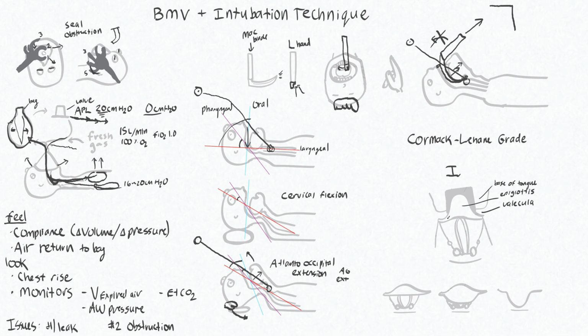And by doing that, you've successfully lifted the epiglottis up. If you do not get your tip of the blade right into this vallecula, it doesn't properly engage the hyoepiglottic ligament, and you may have an issue where the epiglottis is not flipped up appropriately. But this is a good view.